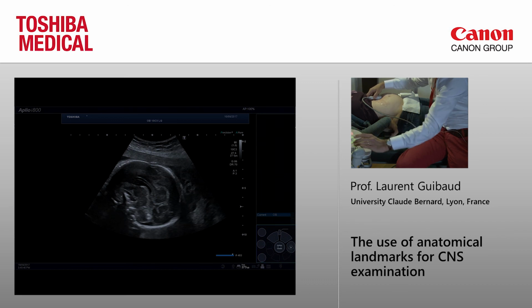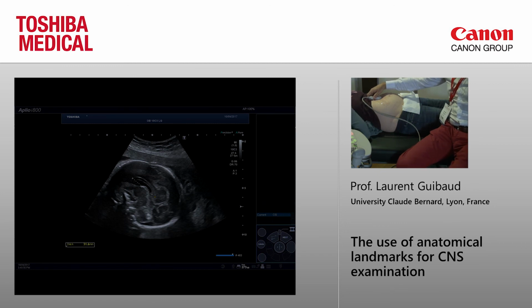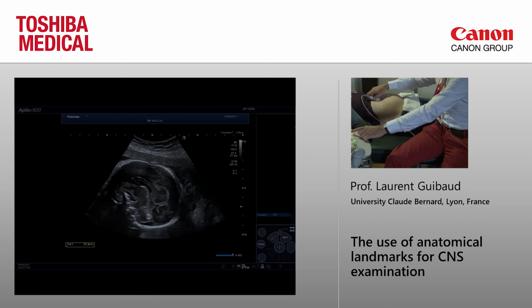And when you measure it, around 22, it will be 22, and this is okay. And at 32, it will be 39, 40. So this is a good measurement for a patient at 26. Okay.